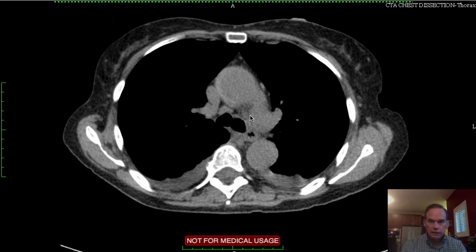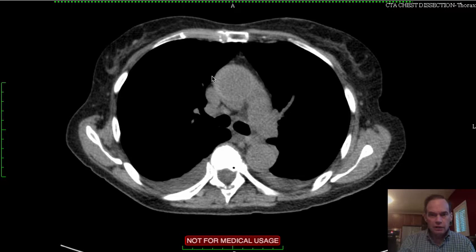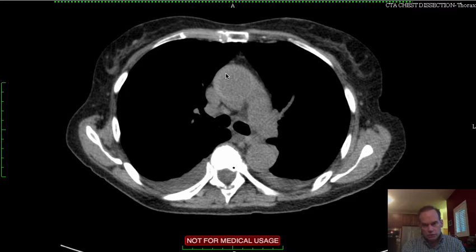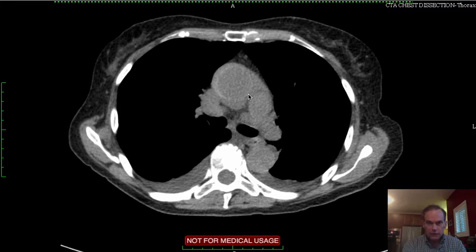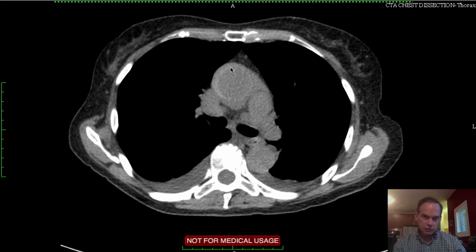Let's follow it down a little bit more. Now it's becoming a little more conspicuous. Smoothly marginated, crescentic. You see how it tapers at each end of this crescent-like structure. So this is the ascending aorta and this is the wall of the ascending aorta in that area. Now we're really getting a very well demarcated, defined view of this mural process, this high attenuation in the wall of the aorta.